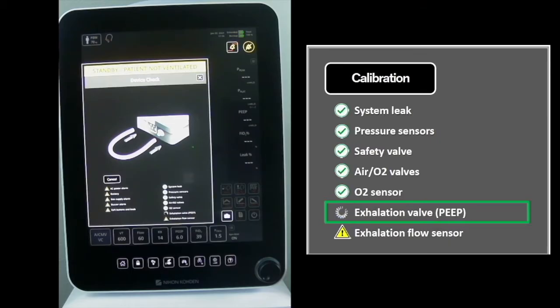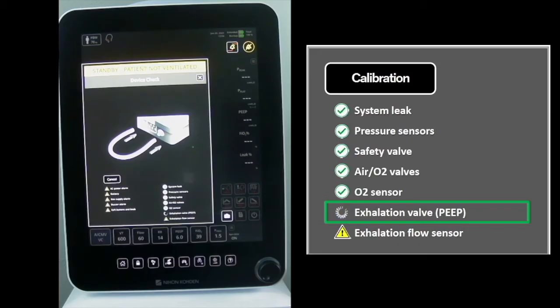The Exhalation Valve PEEP Test is comprised of two stages. During the first stage, the exhalation valve will be exercised to confirm freedom of poppet movement.